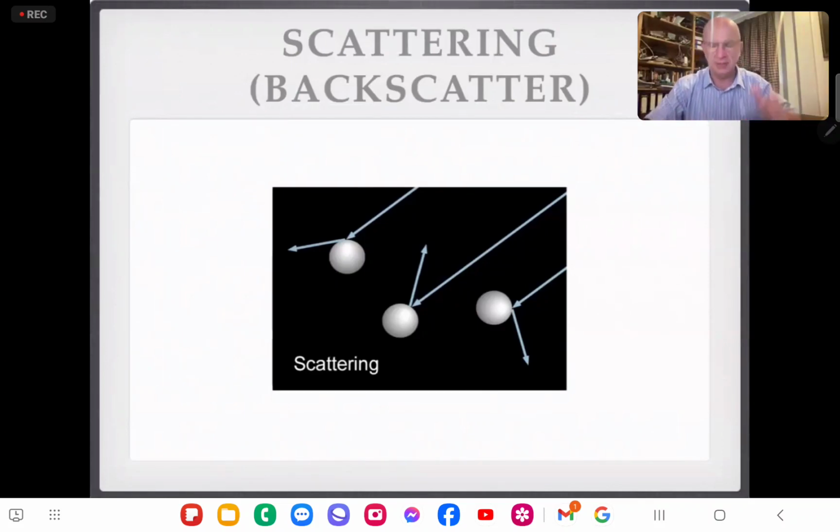The wave hits something small, hits it in the back of the head, it absorbs a bit of energy, it hurts. And what does the kid say? He says, ow. That's just like what happens when a wave hits something small. Wave hits something small, it absorbs a small amount of energy and then releases it in all directions, and that's called scattering. So reflection is high energy, scattering is low energy, because only a small amount of energy is absorbed by the small structure, and then let off in all directions. And that happens when a wave hits something small.